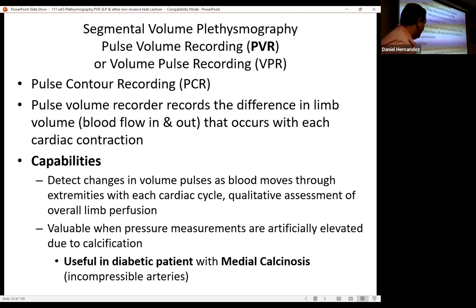So if we're getting normal pressures, but our waveforms look bad, that makes sense, because when I was doing the class with Maddie, the pressures were not compressible for one, but then we went back to the waveforms and they looked normal. So if one's off, you just gotta make sure to check the other. Absolutely, yeah. Okay.